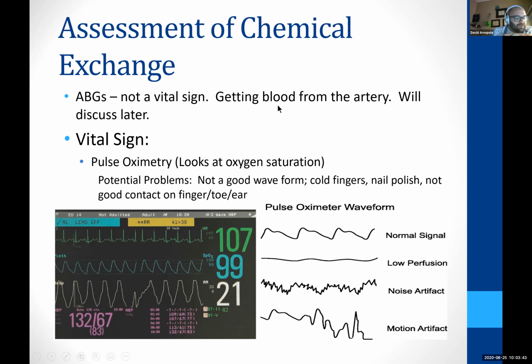Always check your equipment before your treatment and oxygen saturation. The patient may look bad, but you always want to make sure that equipment's right, because if it says 82% and that patient's just staring at you, just talking to you, check that finger. Let's make sure that's actually correct and kind of go around. ABG stands for arterial blood gas, yes.